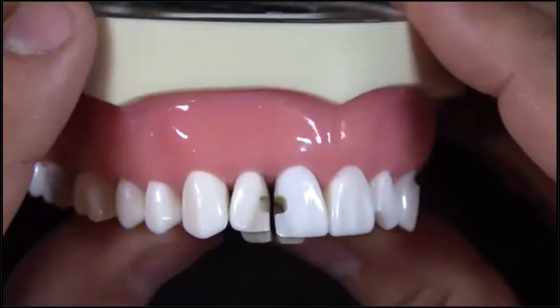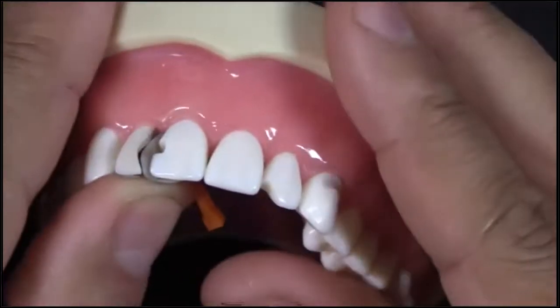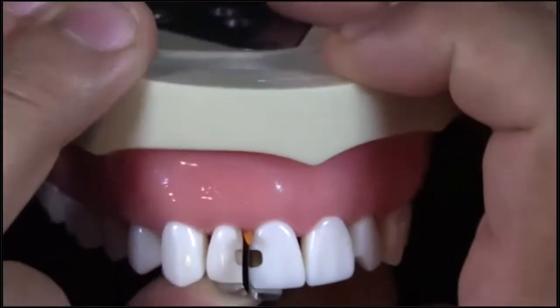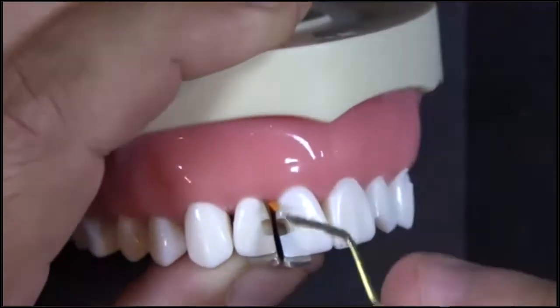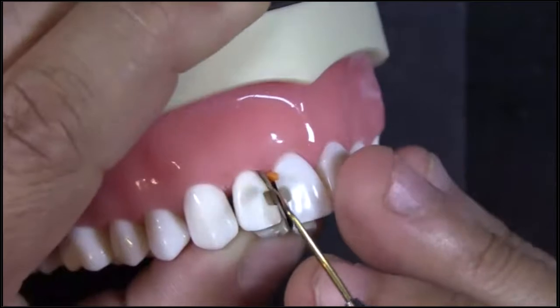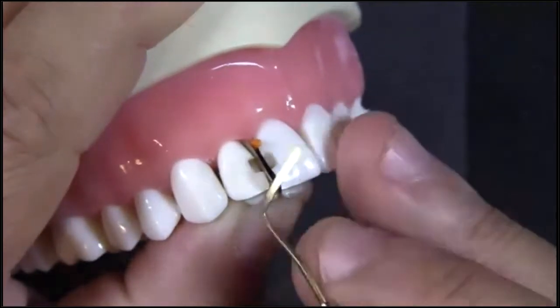And in this situation, I'm going to put a wedge in. Again, I'm going to wedge from the lingual here, hold that down, get that wedge in there. Then I'm going to put composite in, and then I'm going to do what I like to call setting my line angle. There are two different ways you can restore these. You can inject the composite, take a thin instrument like this, and scoop the composite towards the facial surface. That's one way to do it, and that works pretty well.